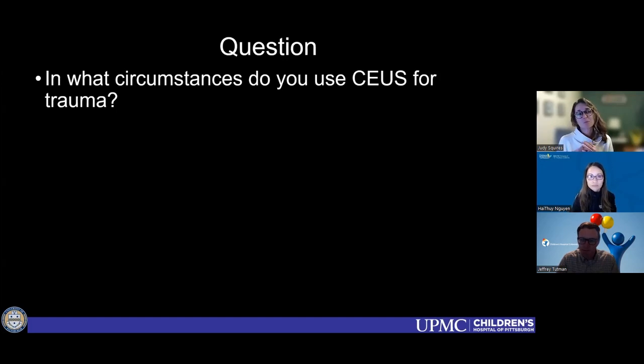My big bias is when we do these contrast enhanced ultrasounds for trauma evaluation, we were part of a multi-site study, and I feel bad scanning a patient who has a seatbelt sign, they're bruised, and as I'm pushing to be able to see, we're actively causing pain. So I'm just like, man, CT is pretty quick. You see everything. You get the renal collecting system injury question answered if you do delayed phase imaging. So I only want to do contrast enhanced ultrasound in traumatic settings for problem solving. I feel bad pushing on a kid who has a bunch of abdominal bruising.